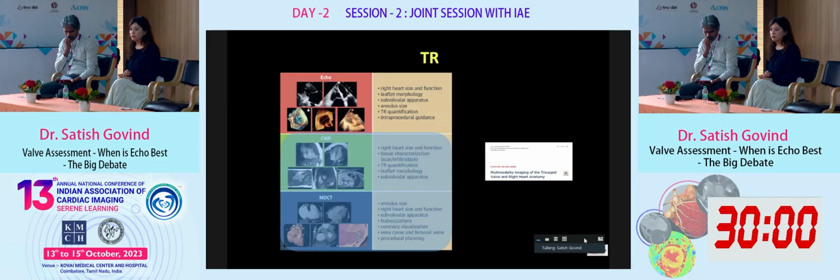Now, when it comes to the use of echo in terms of TR, especially when you are looking at transcatheter interventions of the tricuspid valve, the role of echo is in looking at the size and function of the right heart, and then looking at the valve per se. It is useful there, looking at the annulus to some extent, and then definitely looking at the TR quantification, the severity of TR. Especially if it is severe TR, echo is fairly accurate, but when it comes to moderate and mild, it's not so accurate. And of course, for intraprocedural guidance, the procedure is dependent on the echo itself.